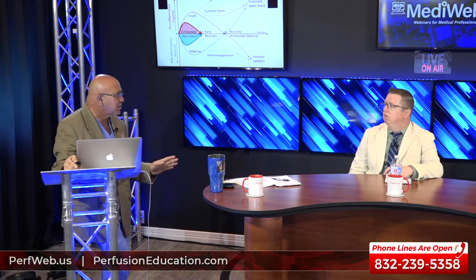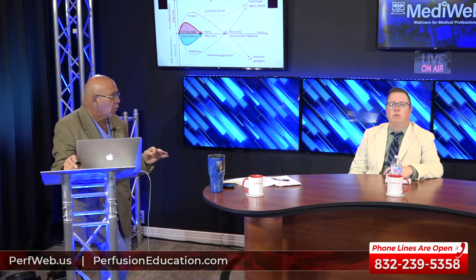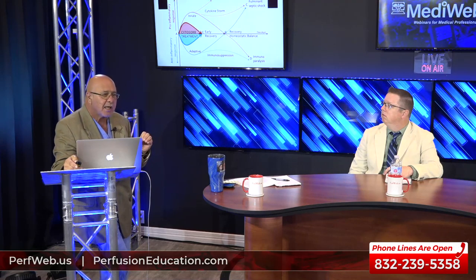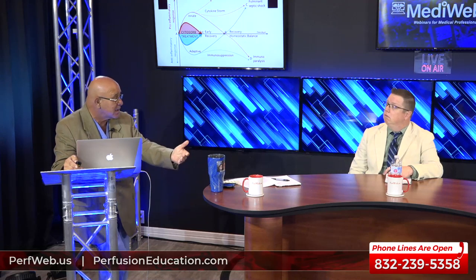But if you're in cytokine storm, you've got to get those inflammatory mediators out of there. We know what happens physiologically. I don't want to go through all of the physiology associated with cytokine storm. We all know what it is, and it never ends well. You've got to control it. So I do think we ought to look more into CytoSorb, but I also think you need to look into this new filter that Baxter has. I don't remember the name of it. I can look it up. But it's supposed to work very well, be more affordable, and be integratable into your already existing CRRT machine.